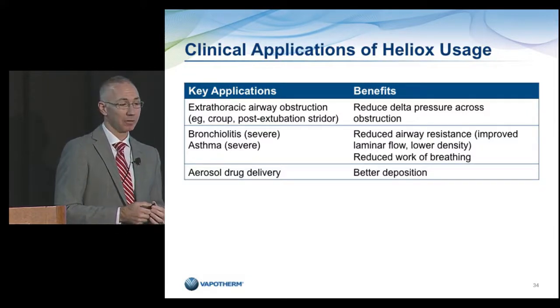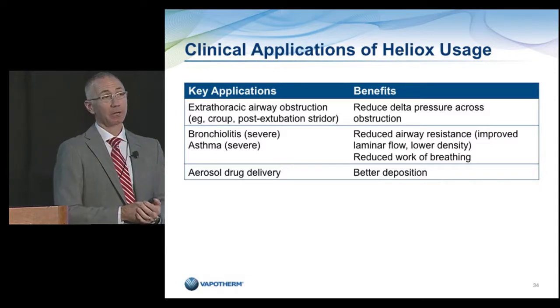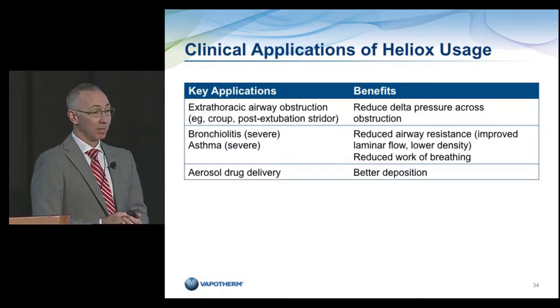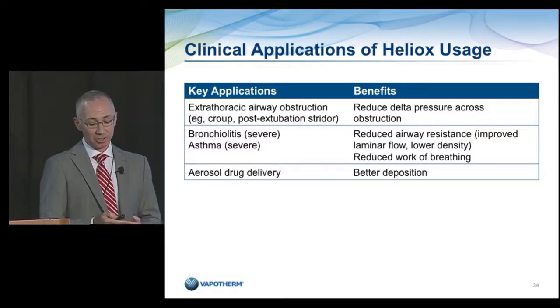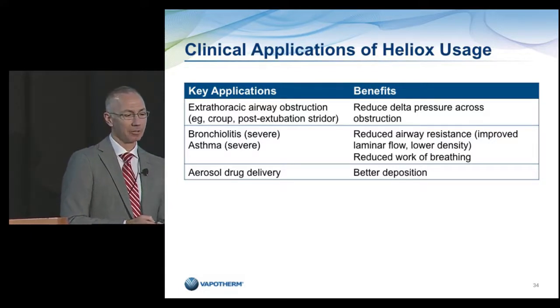with severe obstruction. An added advantage of that is that we now have pretty good data to show that the particle deposition of nebulized aerosol drug is much better on high flow Heliox than just by inhaling nebulization through a simple face mask. So we use that as an added benefit of the application.